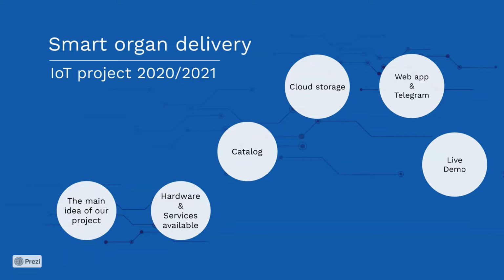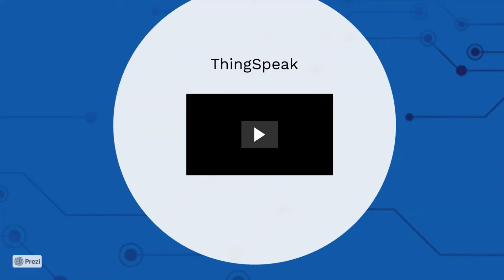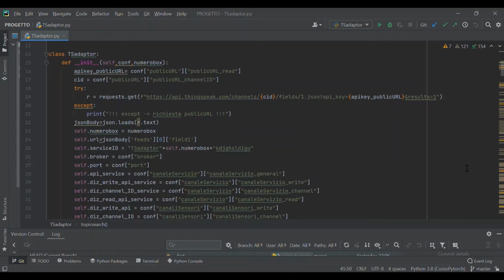The data produced by the sensors and the result of the analysis are saved on ThingSpeak, which is a cloud storage service provided by MathWorks. In this context, the ThingSpeak adapter collects SenML formatted JSON files from sensors and services via MQTT and publishes them on ThingSpeak every 30 seconds. Each sensor and the health status control services has a dedicated ThingSpeak channel where data are collected.